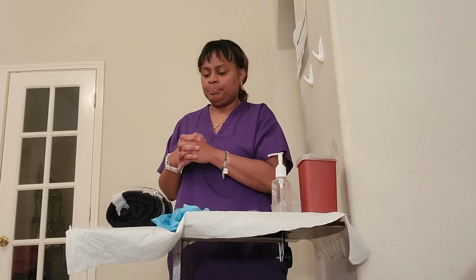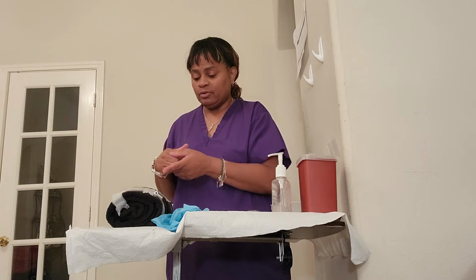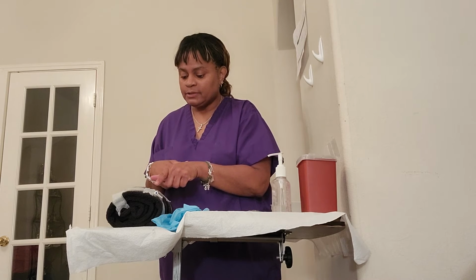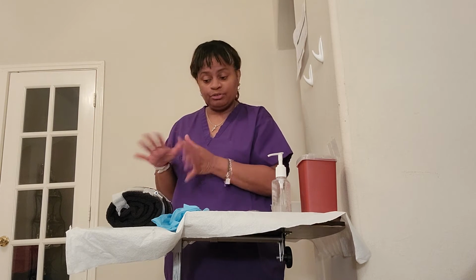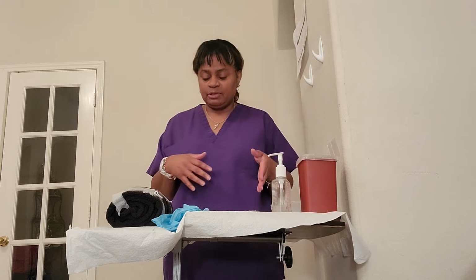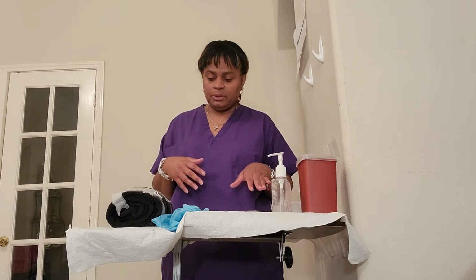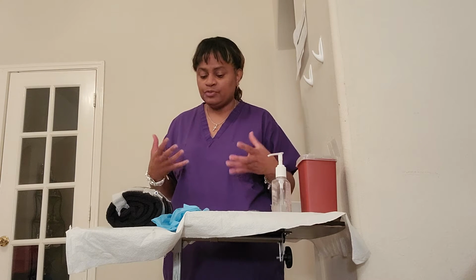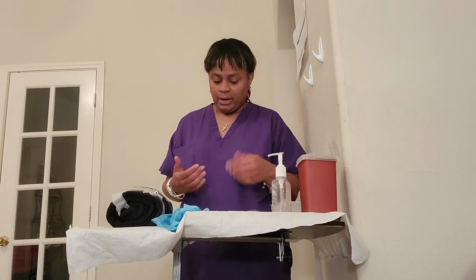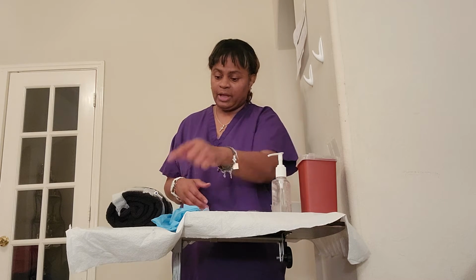Hi, Miss Larson. My name is Cheryl. I'm your nurse today. I'm checking your ID band. Can you tell me your name and date of birth, please? Millie Larson, January 1st, 1936. Great. Thank you very much. Are you allergic to any medication? Awesome. Okay, so today what I'm doing is I'm administering some IV fluids to you, and it is going to be sodium chloride. It's just really basic for hydration for you right now. If you have any questions, you can let me know. And right now I'm going to start to get everything together for you. Okay, it's going to go right here through your site.